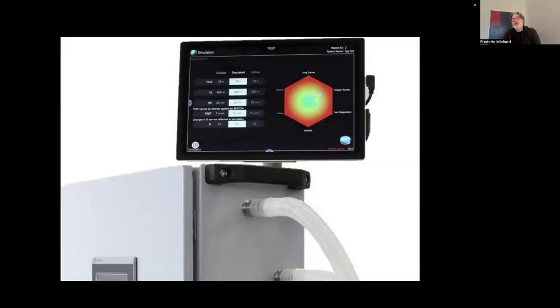So here's a commercial version of this concept developed by Fabrice Vallée. So far, I discussed mainly hemodynamic monitors because it's a topic, sorry, I'm very interested in, but similar tools have been developed for physiologic variables. And here you have the example of a polygon developed to integrate FiO2, tidal volume, respiratory rate, PEEP, and the I/E ratio. So once again, in case of deviation from normal settings, that will become immediately visible on the screen.